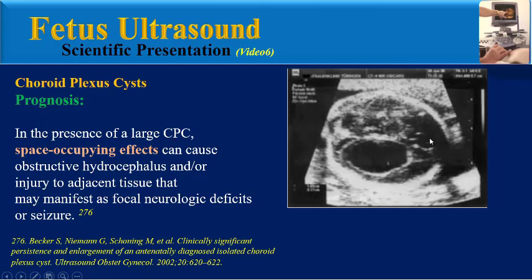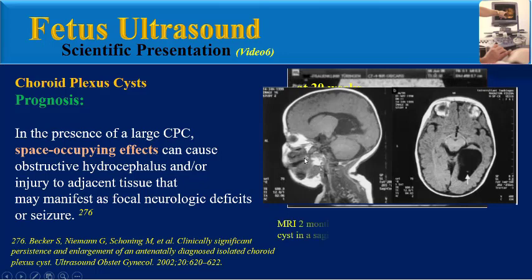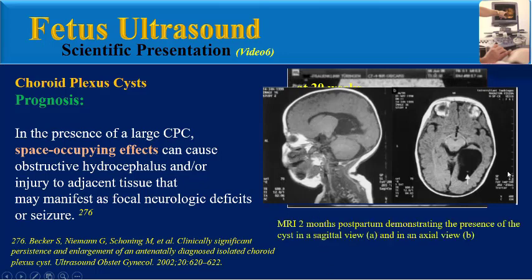This image shows large choroid plexus cysts at 20 weeks. And this brain MRI, two months postpartum, demonstrates the presence of large cysts causing mass effects on adjacent brain parenchyma and ventricles.